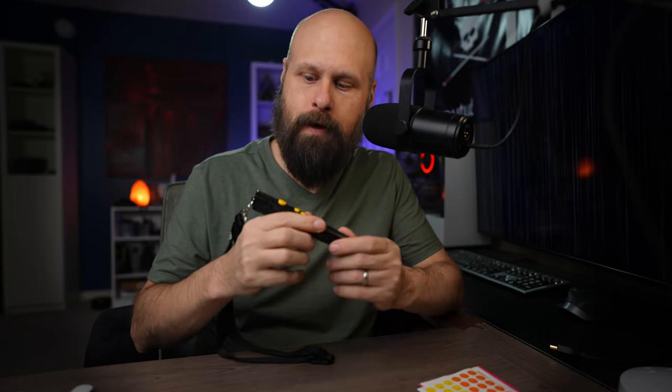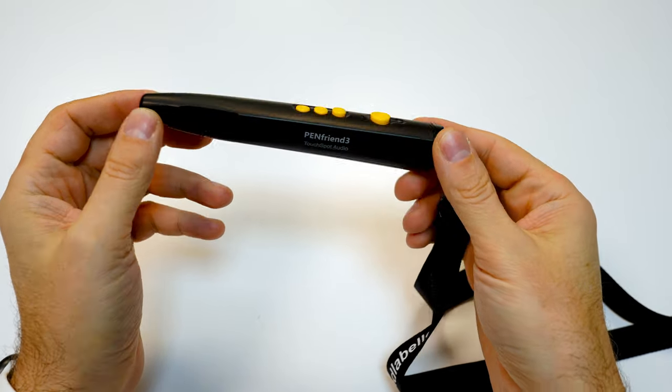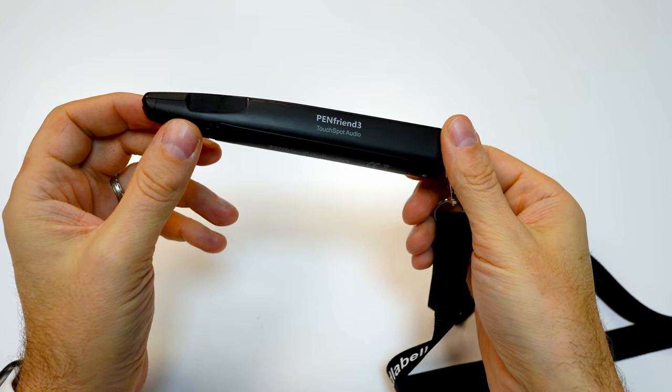With this third generation, they have improved it in several different ways. Number one, the form factor is better — it is smaller and it has these high contrast yellow buttons now. Not only can you create the audio labels with the Pen Friend, which it's always been able to do, but now you can also download MP3s and talking books and put those on the Pen Friend as well. We'll talk more about that, but the audio label recording is the main function.